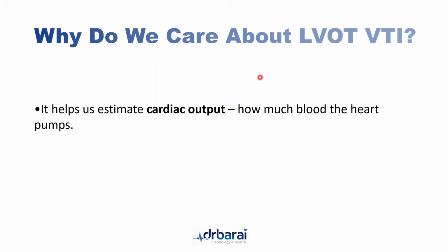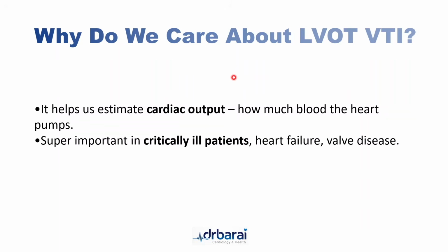If we know exactly what the cardiac output is, then we can understand if the person is doing well or needs some help and support. This is a non-invasive procedure that we can use on the bedside with a portable device. So I find it very useful in my day-to-day practice. In addition to that, it is super important in the critically ill patient, especially with those who have got hypotension or shock, heart failure or heart valve disease.